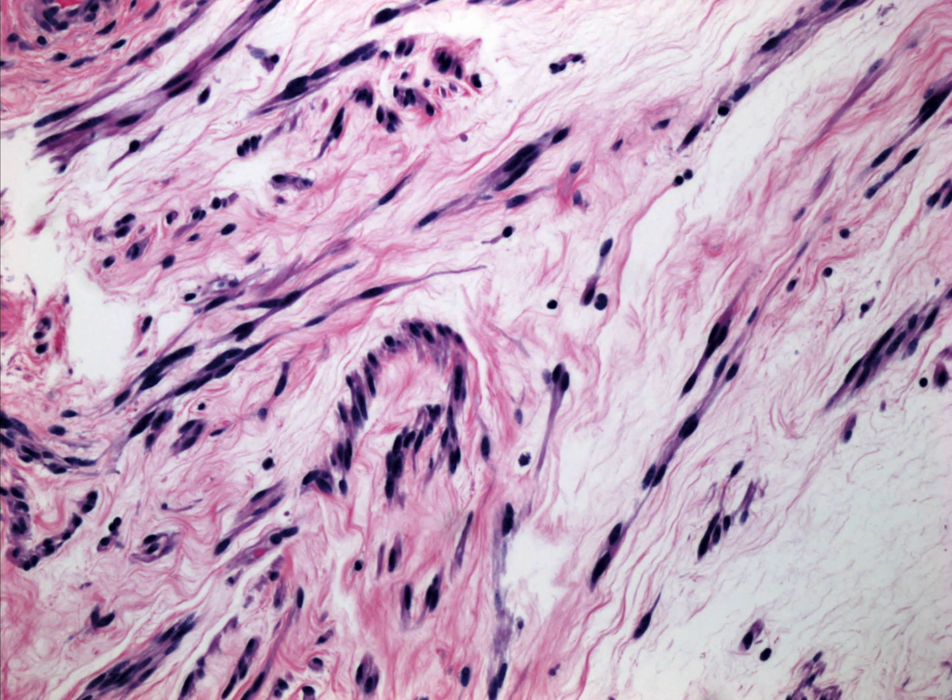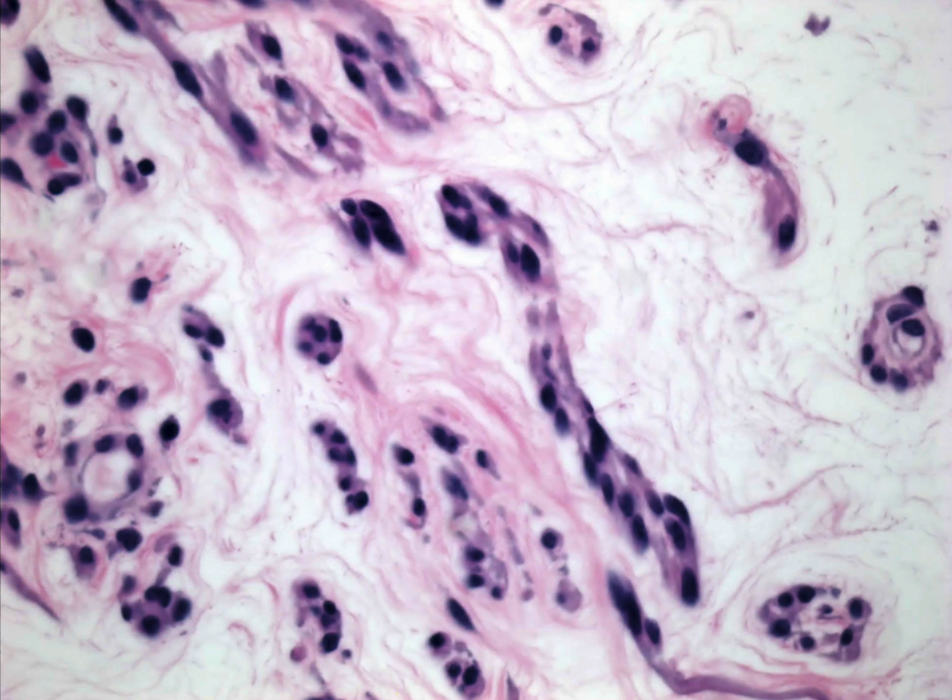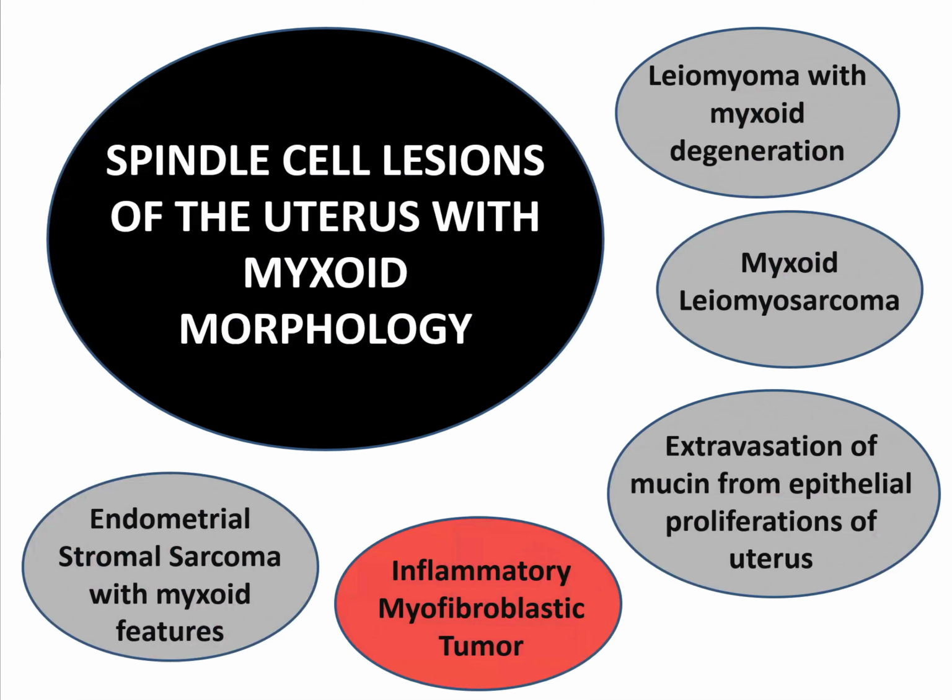And on a higher power, the same thing. So a good idea of that. And then even higher power view of that nice sort of hydropic change between the cells.